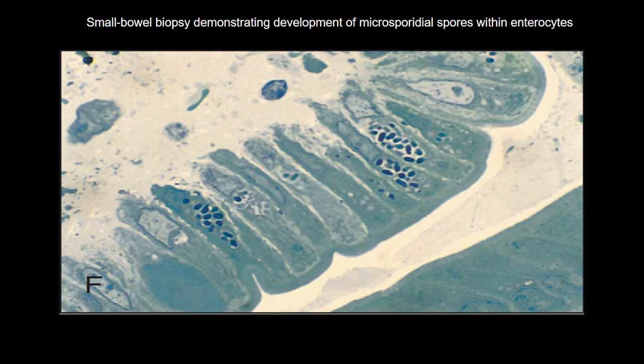And many of these protozoa, sometimes in patients, can also be identified by using the fluorescinated antibodies, especially for the protozoa that can be isolated from the gastrointestinal tract in general.